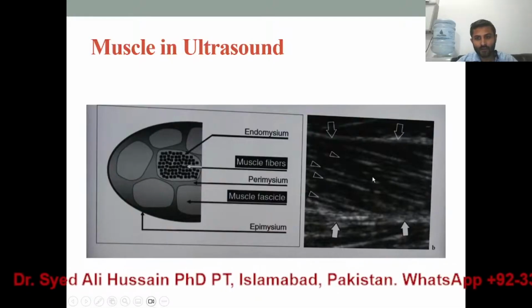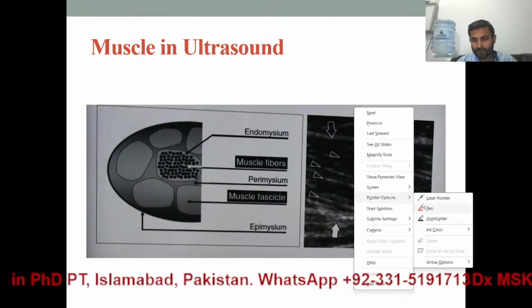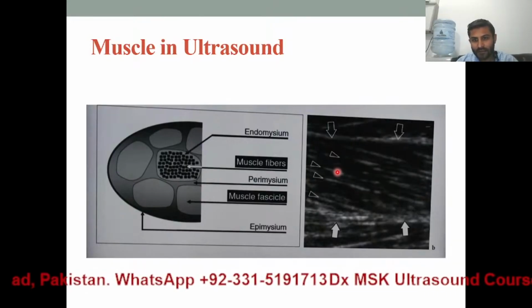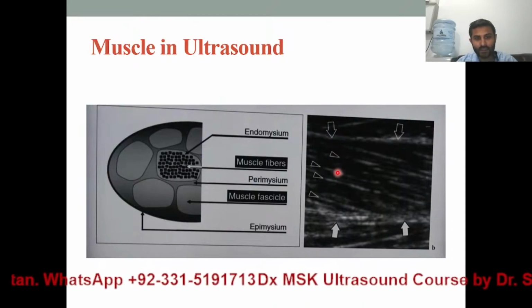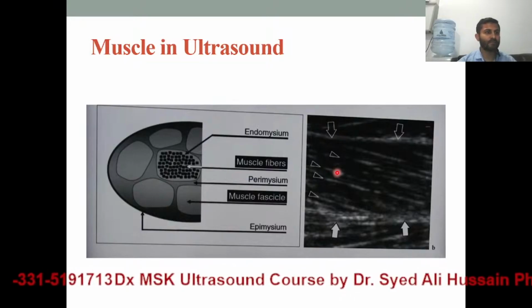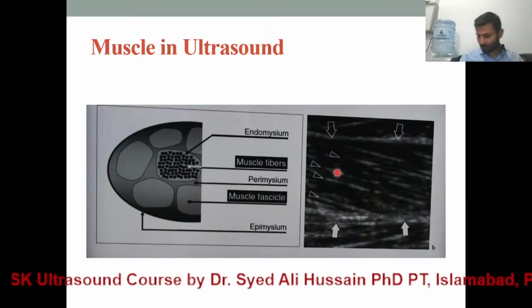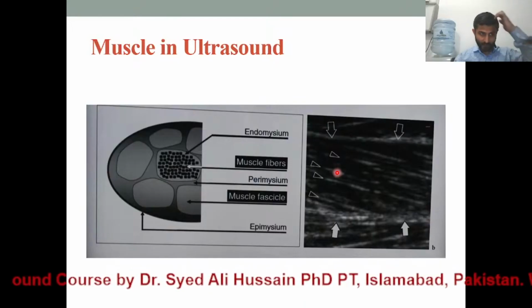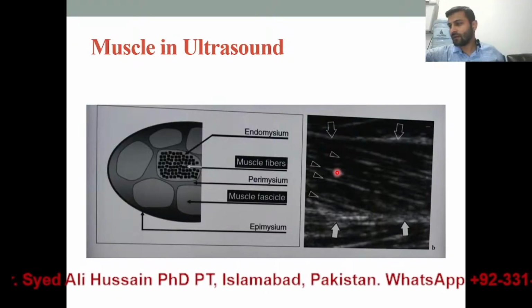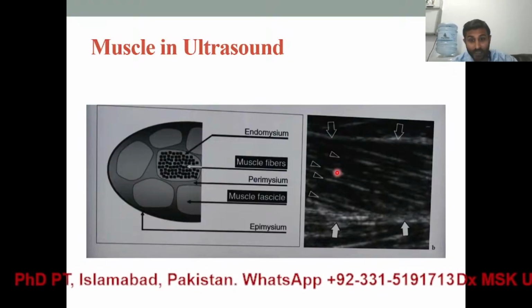If you look at these white lines, these are called hyperechoic. I am repeating, these are called hyperechoic. Hyperechoic means when a structure is having more echo, means it is appearing more bright.